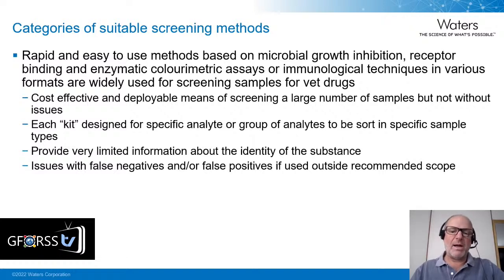If you apply a kit that's designed for a certain scenario into a different scenario, because that's what you need, then you may find issues with false negatives and false positives. Hence, again, this is an important thing to stress: these kits need to be validated for the use that you need.